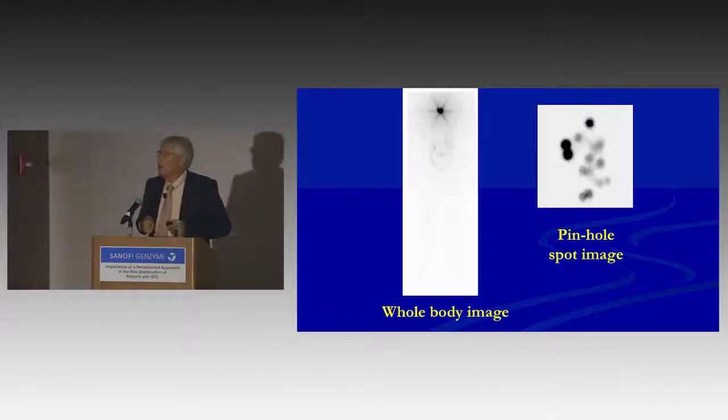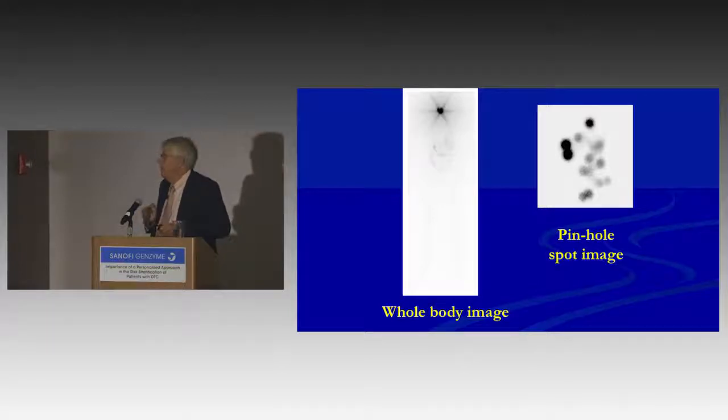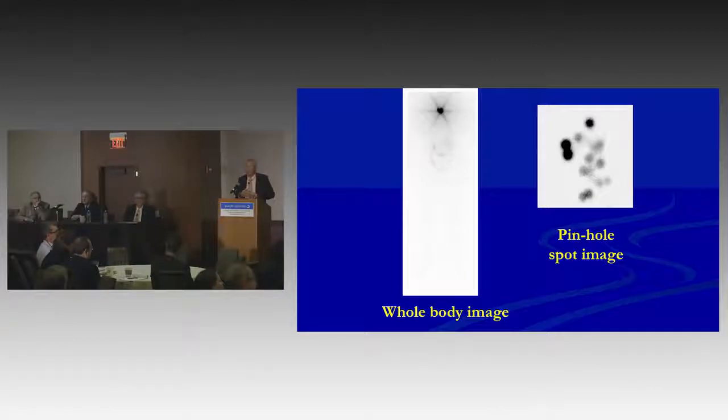When you see that star artifact in the future, instead of thinking that's normal residual thyroid tissue, what you need to be thinking is, I can't assess that area. I haven't the foggiest idea what's in that thyroid bed. And I would provoke you then to go to your nuke med physicians and start to have a dialogue.